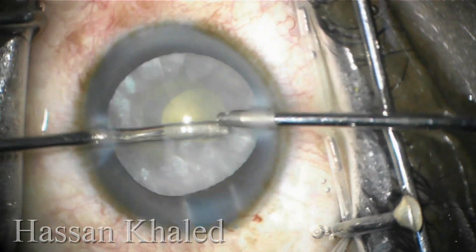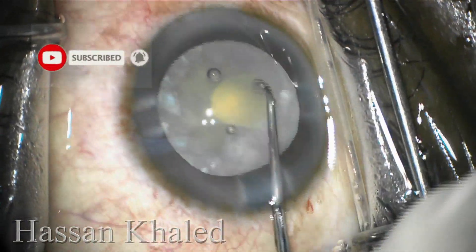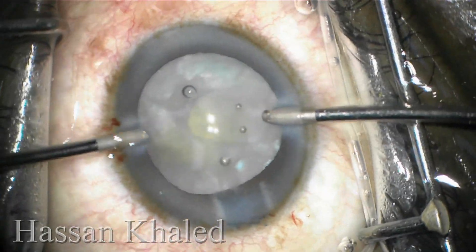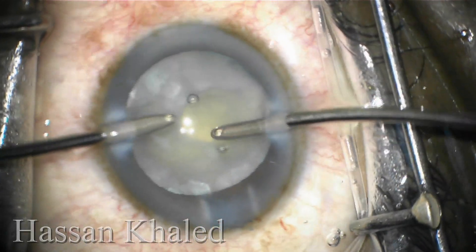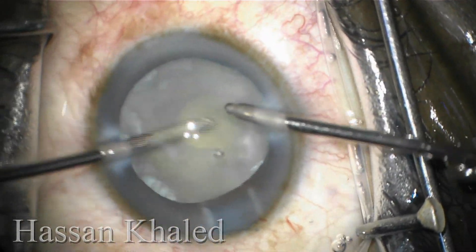As you can see here, I'm trying to decompress the intralenticular pressure. Here I'm going to apply gentle pressure over the nucleus, rotating the nucleus inside the capsule to give space for the liquefied cortex to come to the bimanual irrigation aspiration, as it's clear.